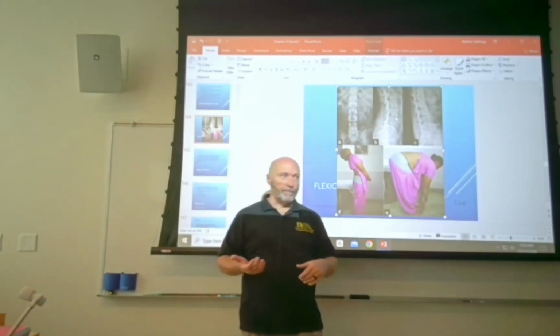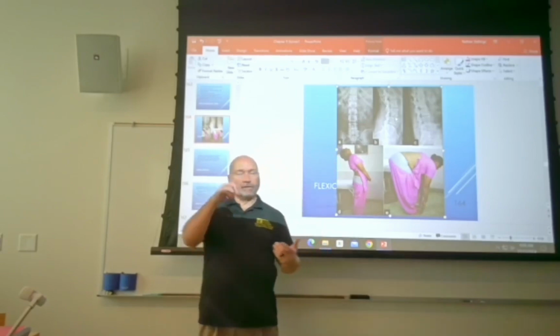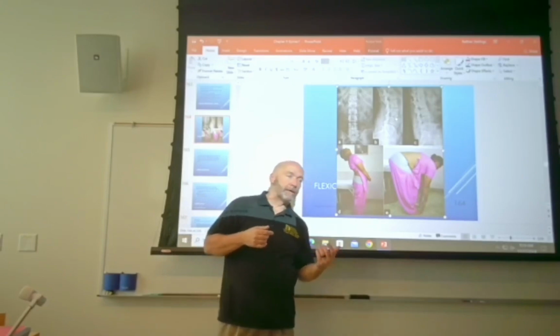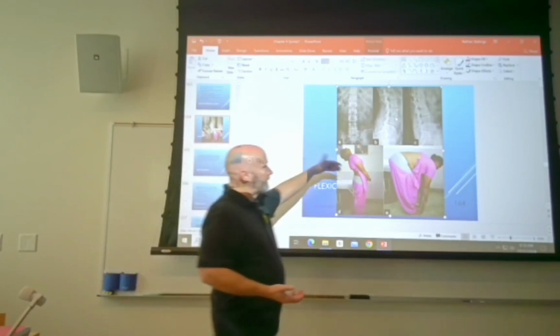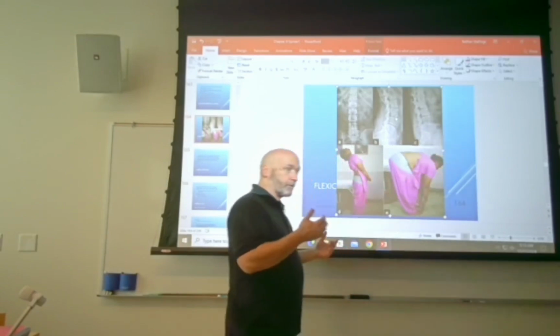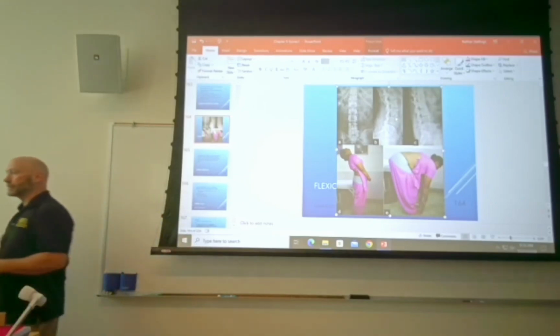Also for mobility, sometimes because the patient has scoliosis. If they've got some moderate scoliosis, they may not be able to bend quite so far in one direction as opposed to the other. Okay, so in both cases are for mobility. Flexion and extension tends to be for spinal fusions post-op. Lateral bending can be as well, but it can also be for scoliosis series.